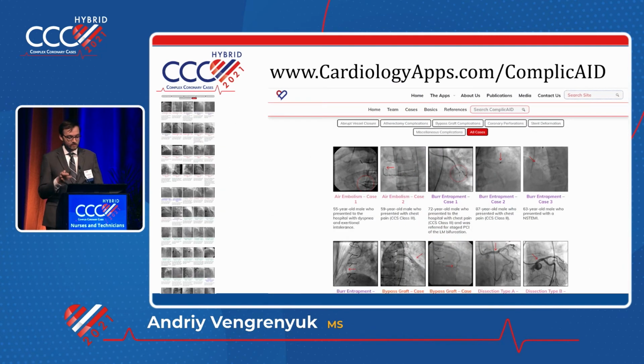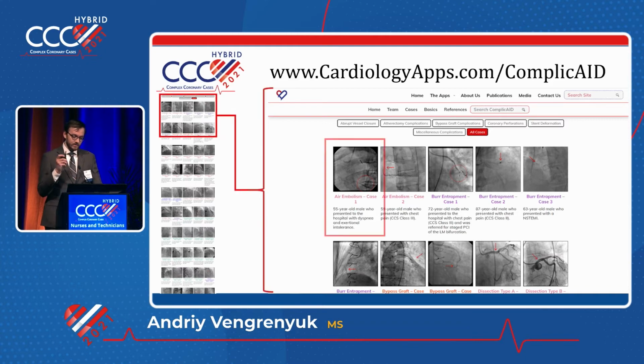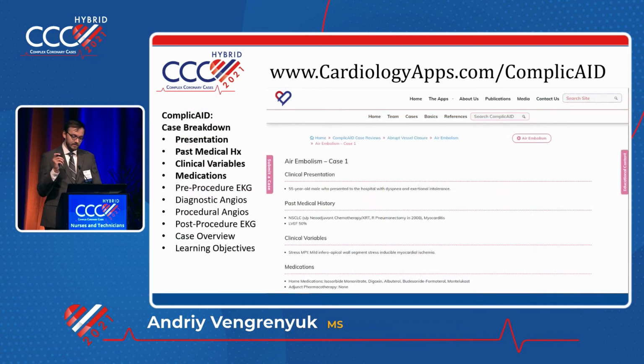If you click on cases and you don't want to go through the pretty UI, you can see a list of all the different cases here. All of them have been carefully reviewed, largely thanks to Gurpreet Johal, one of our interventional fellows, research fellow in the 2-year track. We're going to look at just one such case, air embolism here. They're all presented the same way.